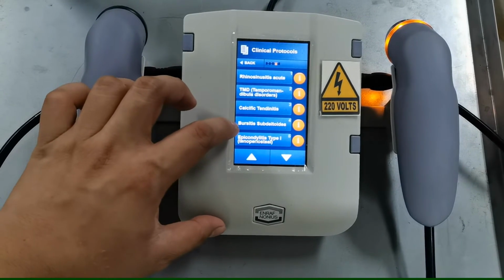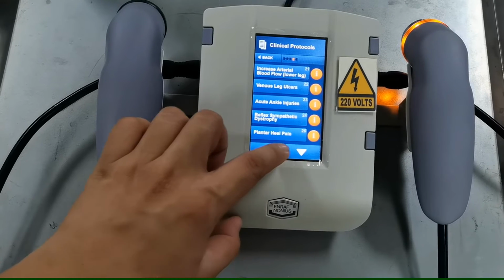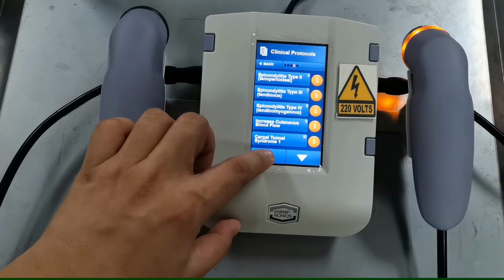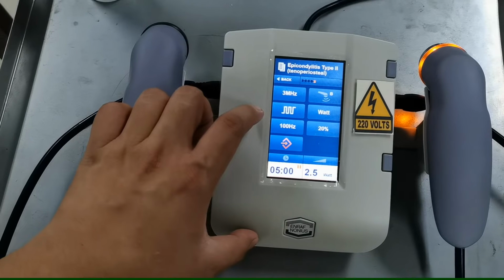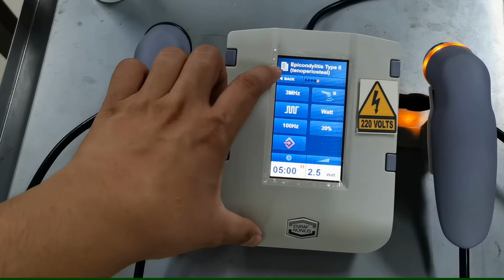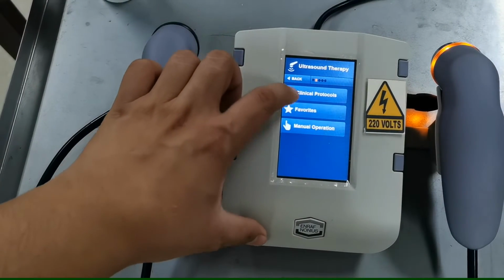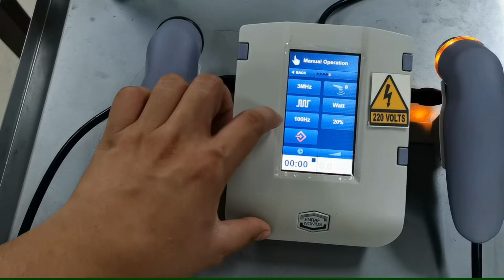So let's check the clinical protocols. Here it is. So for example, you've selected epicondylitis. Now this would be the recommended parameters for epicondylitis. Okay, so this is for the manual operation.